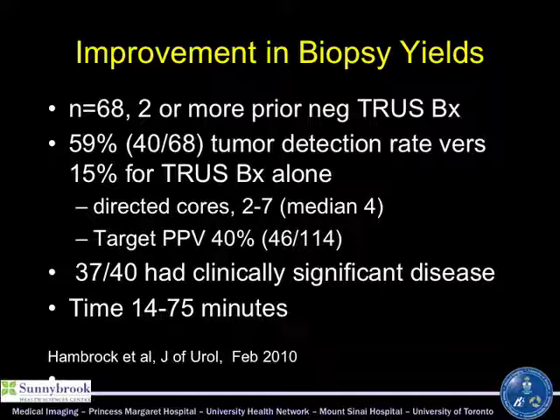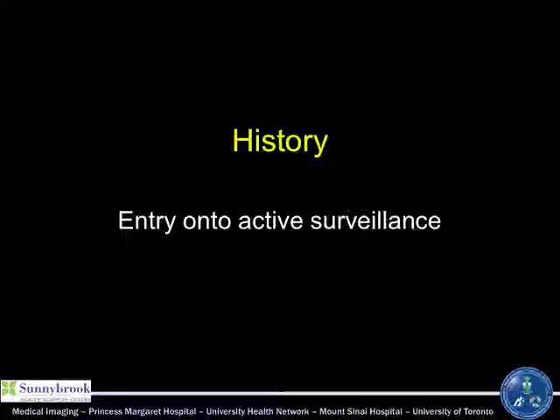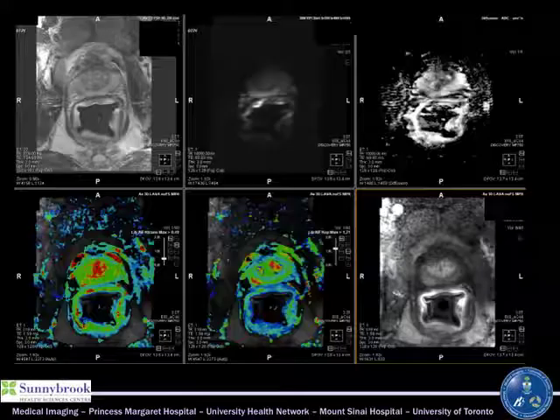This is an MR-guided biopsy approach. I reviewed with the residents a paper that was an ultrasound MR-fused approach with also very good results. I won't be presenting that here, but I know Samir has put together a nice summary of that. And then when you look at where the cancers are positive, it's exactly what we'd expect. The hotter colors are where the biopsies were positive. So anterior, central, posterior areas that are not normally sampled as part of the routine are where a lot of these biopsies were positive.